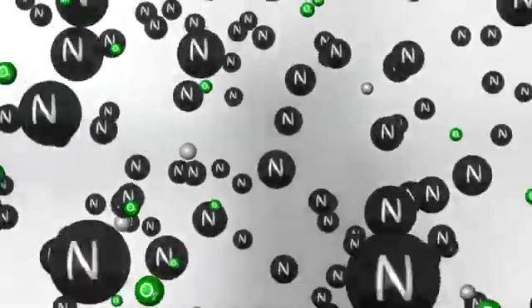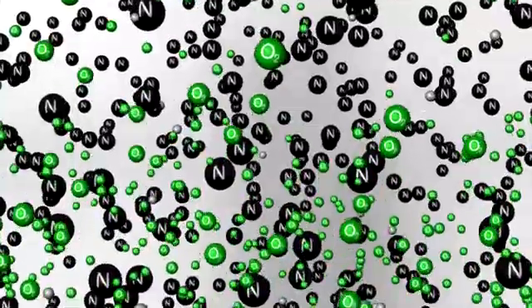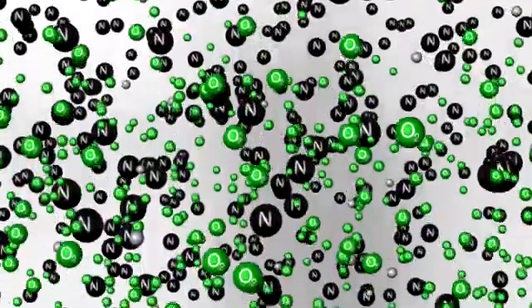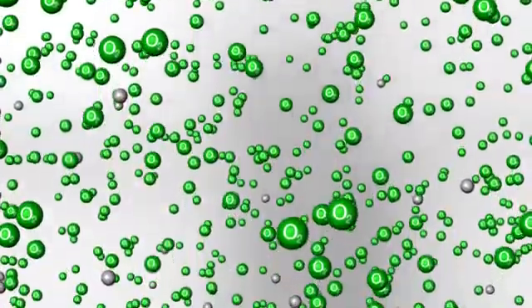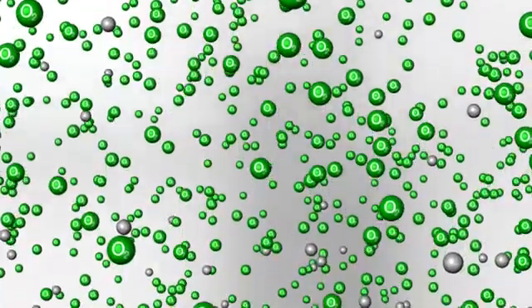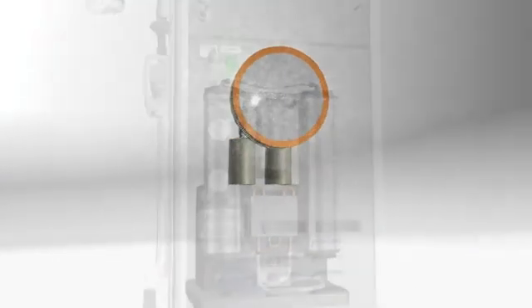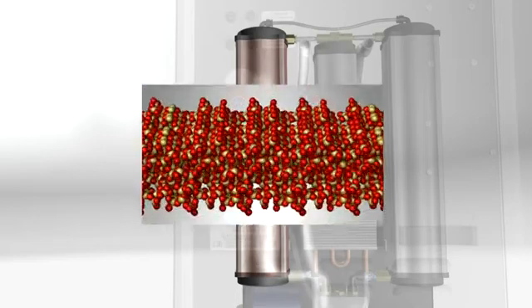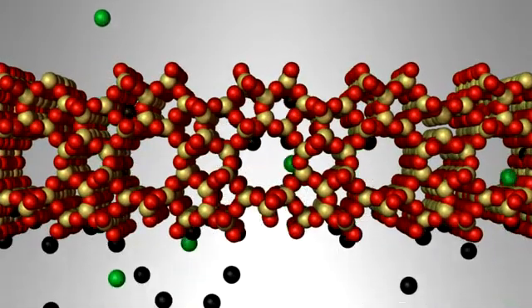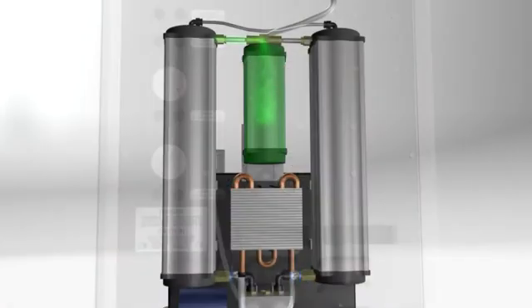Ambient air is made up of 78% nitrogen, 21% oxygen, and 1% other gases. The oxygen concentrator in the UAM removes nitrogen from room air, creating a mixture that is 95% oxygen and 5% other gases. Air is drawn into the UAM and is purified by 3 different filters. The compressed air passes into a canister filled with a powdered material called zeolite. Nitrogen sticks to the zeolite, while oxygen and other gases flow through it to a reservoir tank.